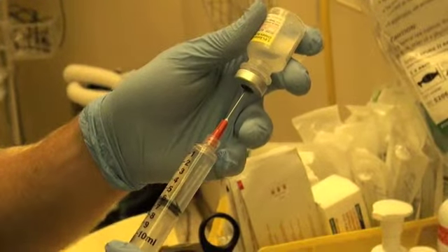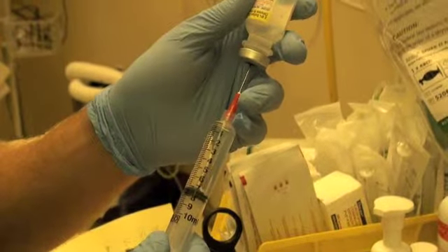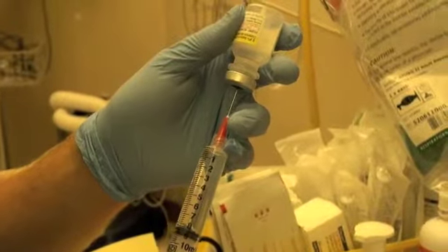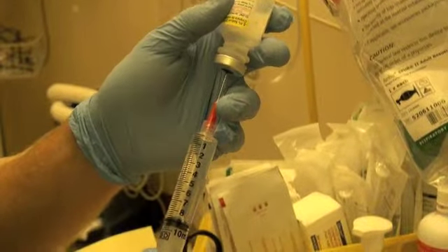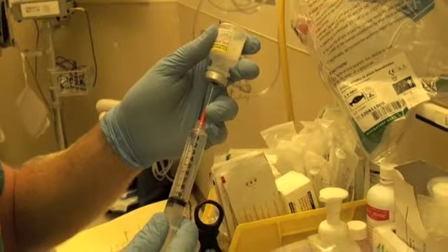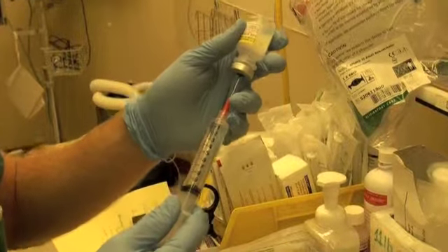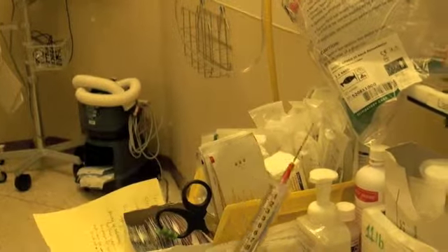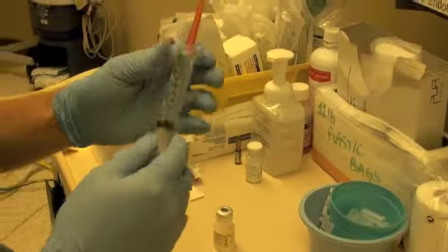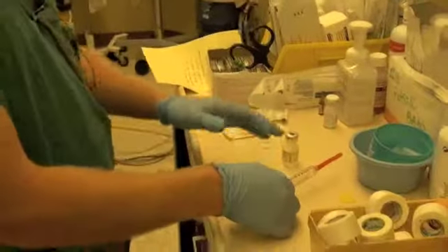If it's above the meniscus, you're going to be pulling back air, and you're not going to be getting the volume that you desire. So eventually, you're going to pull the needle back to the bottom of the vial. And we should be right at about 10 milliliters. So, if you were finished with this, you'd cap the needle, label it, and then store it until you're using it.